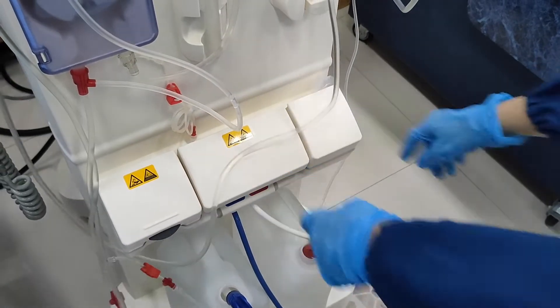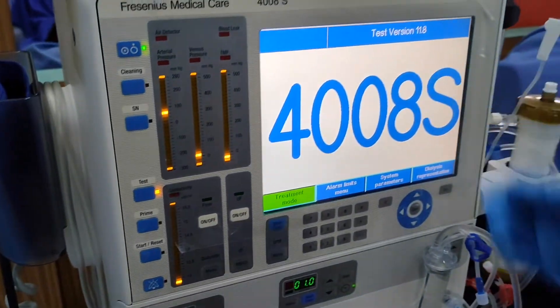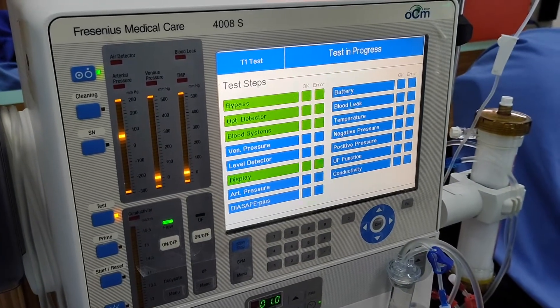Once they are in place, press the Test button for the T1 testing which will be analyzed and tested by the machine itself.